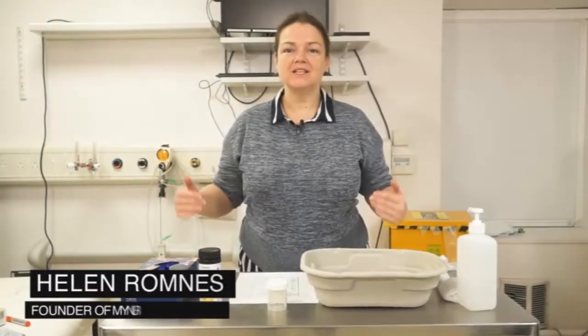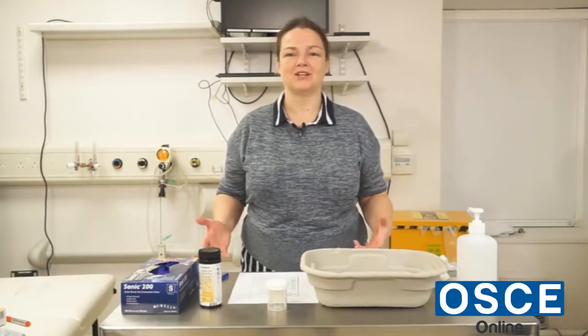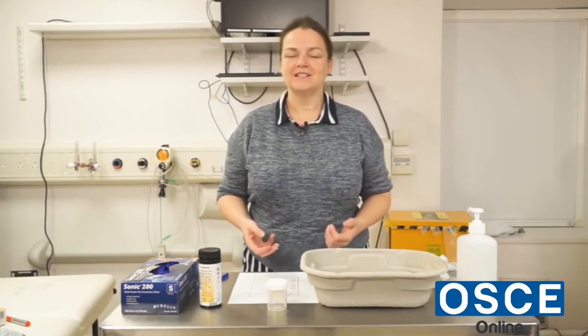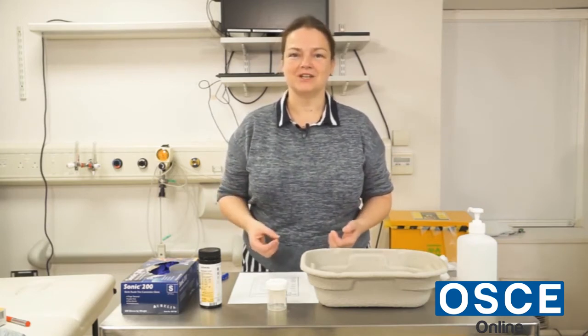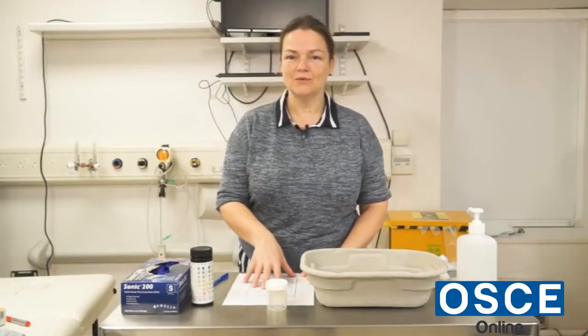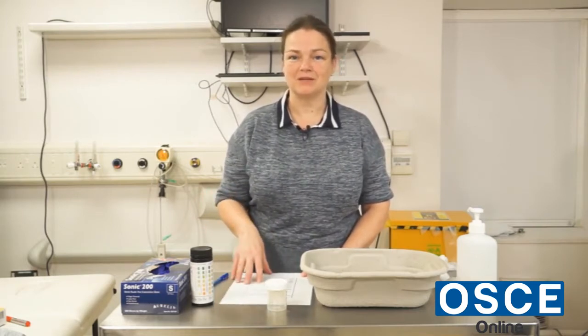So this is the midstream urine sample, and I'm going to go through the steps of it now. There's two parts to this. First of all, I'm going to explain to a patient how to take a midstream urine sample. Then I'm going to obtain the sample from them, and I'm going to take a dipstick urine. I'm going to analyse it against the dipstick pot, which has the results here to measure it against, and I'm going to make some notes which will go with the sample to the laboratory. So I'm going to explain all that to the patient now.